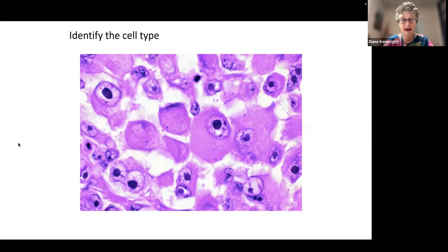These ones are epithelioid cells, so I think they look like fried eggs. This is the white of the egg and the yolk, and they've got this great big nucleolus. Now, it can be quite tricky because sometimes cross-cut spindle cells can look quite like epithelioid cells. But the key thing is usually they have really big nuclei and a ton of pink cytoplasm.